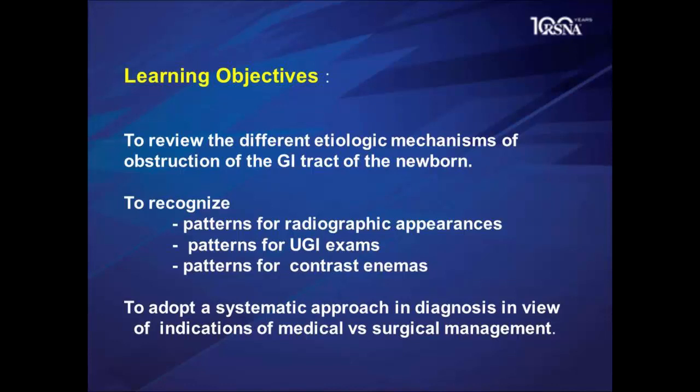Hopefully we'll have an idea about the systematic approach in diagnosis in view of indications of specific treatment, with examples illustrating either a medical or a surgical management of these conditions.